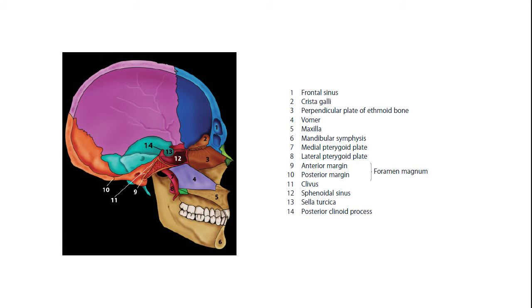It must also be emphasized that it is the fundamental underlying relationships of the structural components of the facial skeleton to one another and to the craniofacial complex that need to be established and evaluated, with the aid of the clarification afforded by using selected parts of the relevant cephalometric analyses as diagnostic guides. A thorough knowledge of craniofacial dentoskeletal anatomy is paramount to understanding cephalometric analysis.